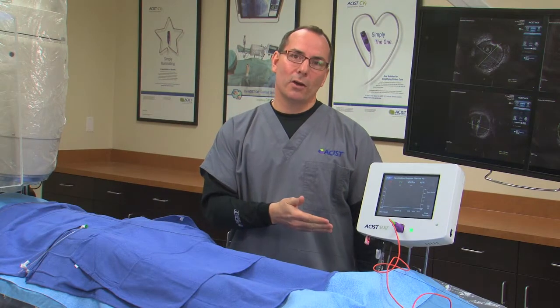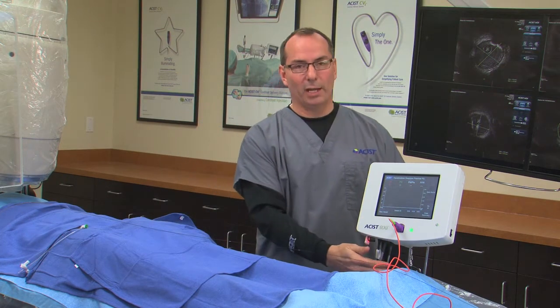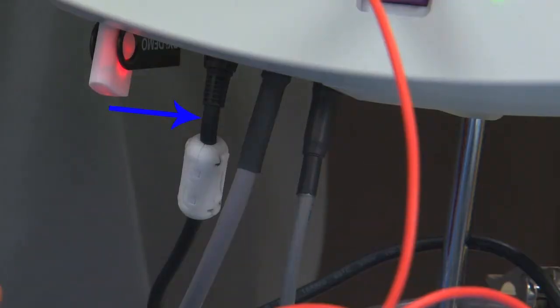Let's take a look at the RXi console itself. The RXi console has 3 cables on it. The power cable, which supplies the unit with power. The second cable brings the patient's aortic pressure into the console for FFR calculation.